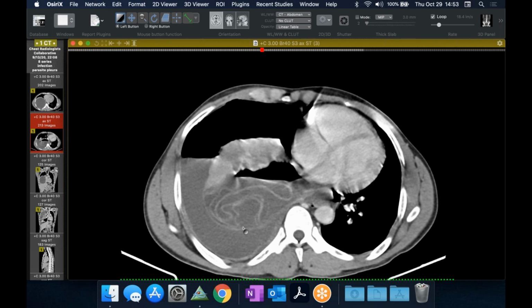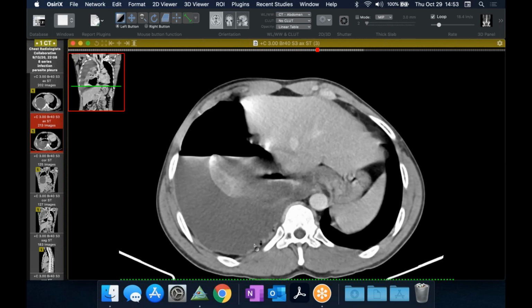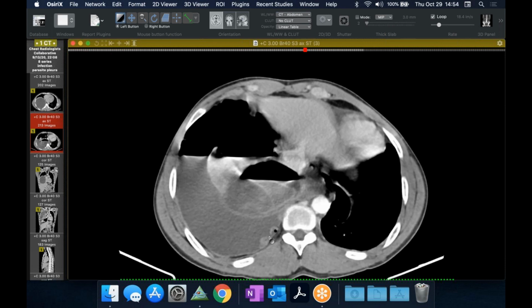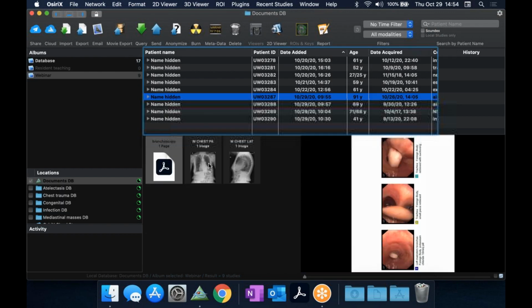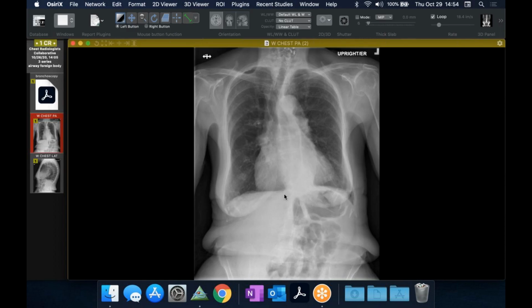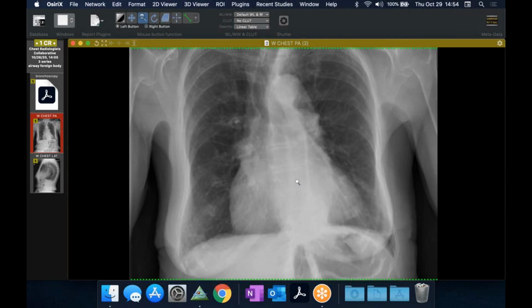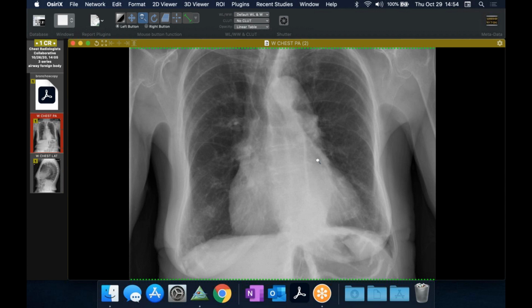And many of the connective tissue diseases, especially when they're managed with normal medications, a lot of times this will stabilize, especially in scleroderma. She still had some debris in her esophagus, so I strongly suspect this is probably going to be a scleroderma or something along that spectrum that just hasn't been worked up yet, and I think she's now going to get a workup.